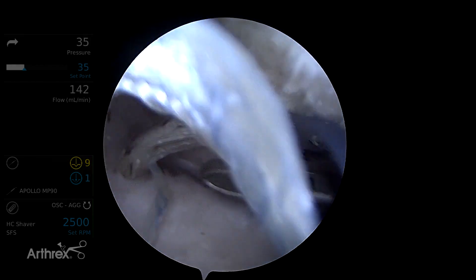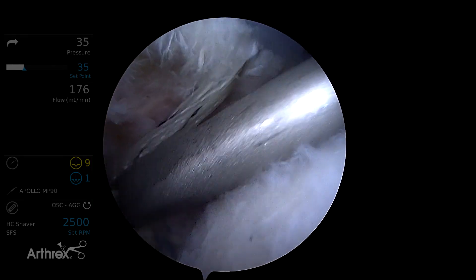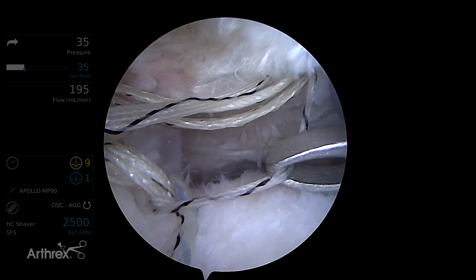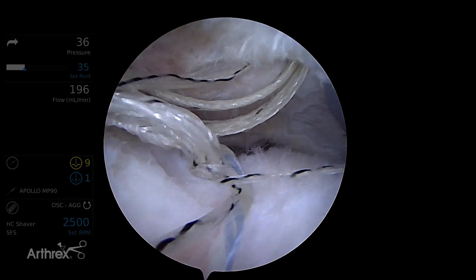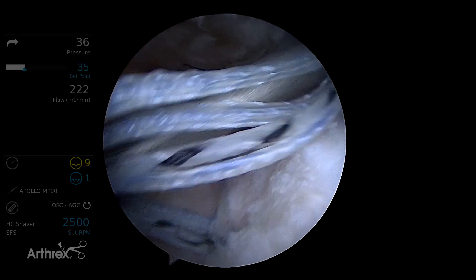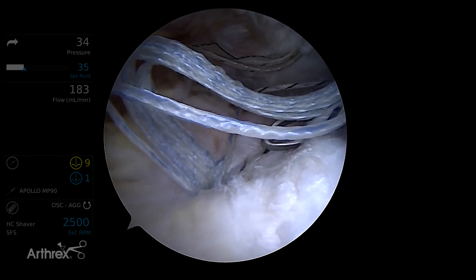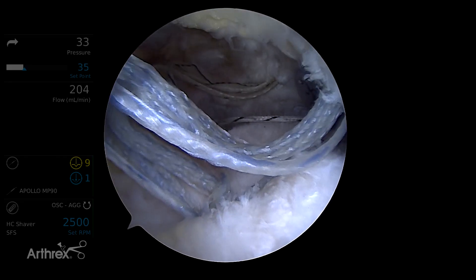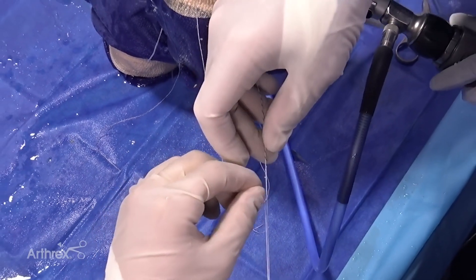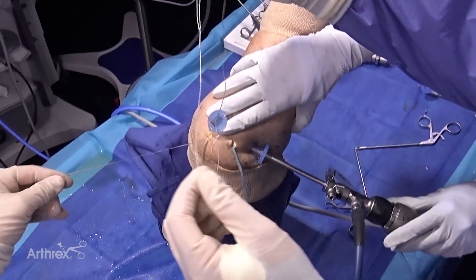Now we're going to do the opposite on this side. We're going to take the passing suture from our anterior anchor — so what we want is the looped end of the passing suture. We pull on the looped end to take the slack out, then let go, pull that out through the lateral working portal, and then come to our posterior group of sutures, create laxity, and pull on our working suture, which is the black and white one. Then we fold that white end back on itself until the very tip of the suture gets to the junction with the striped part, and now we'll just thread the splice.